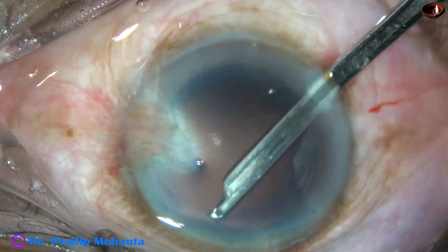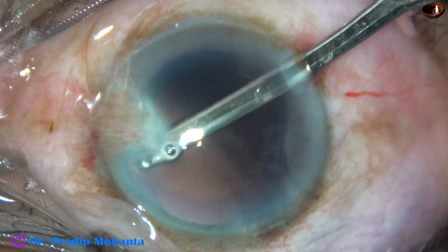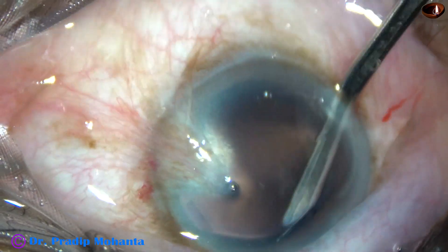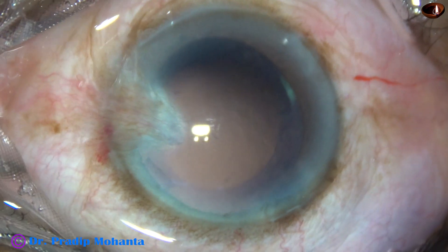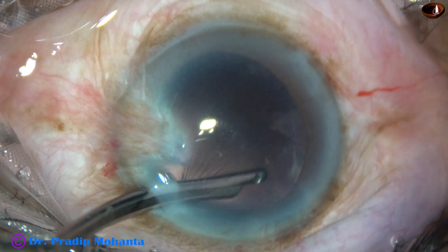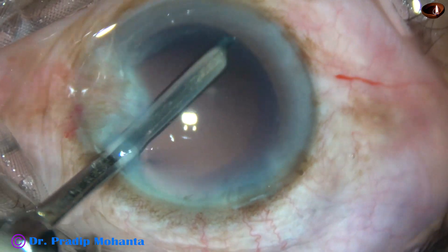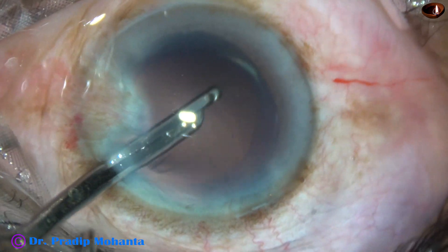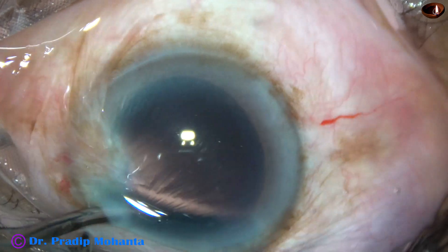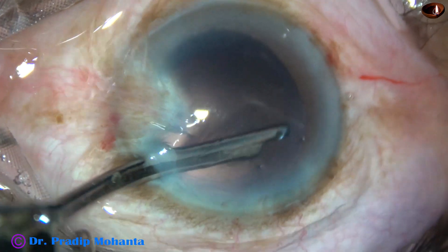It's a very safe instrument, particularly in the hands of beginner eye surgeons. You probably have done SICSs and are already used to this instrument. Only thing is, they make the side ports 90 degrees away from the main incision, so that astigmatism induced by the main incision is neutralized by the slightly wider side ports.